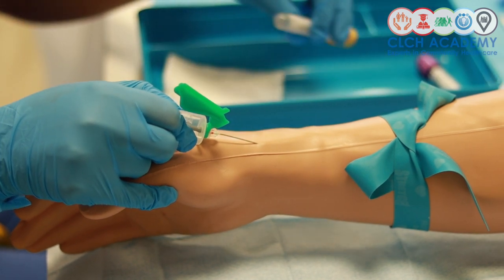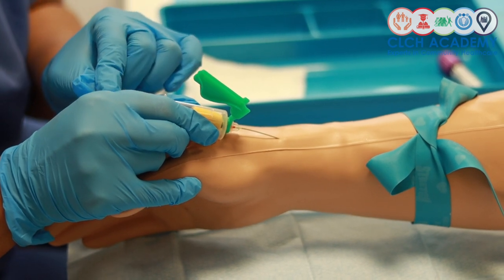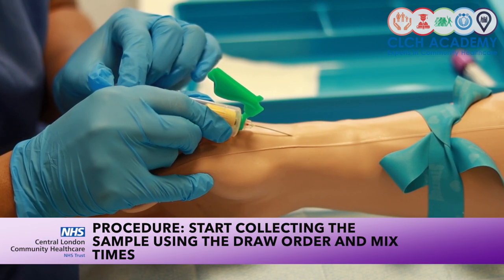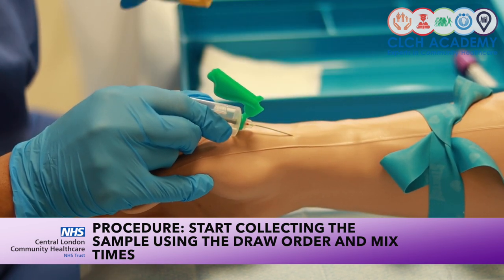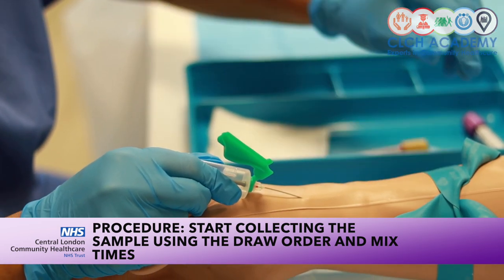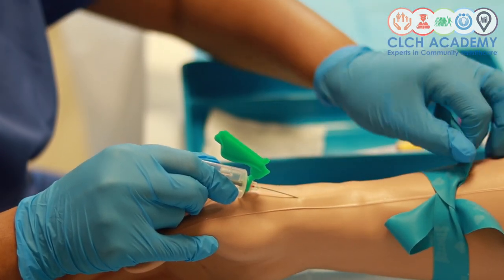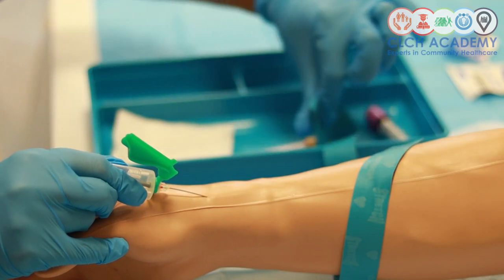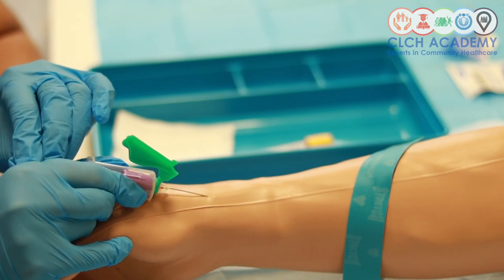I will start off by introducing my chemistry bottle. Collecting my sample, sufficient blood, taking that out and doing my inversions, 5 for this one. Then removing my tourniquet, as my tourniquet only needs to be on until I fill up my first bottle. So releasing my tourniquet, going on the long side again, slipping it gently and releasing it, and then collecting my second sample, which is the group and save.